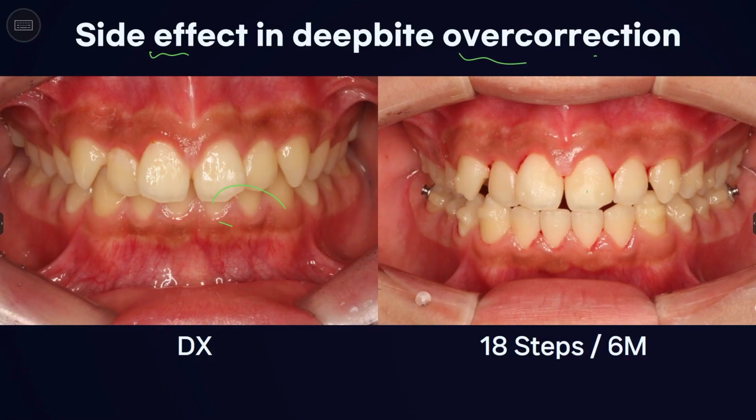So, when deep bite improvement is planned during the staging, it's important to closely monitor the occlusal changes throughout the period. I recommend more frequent observation, such as every 3 aligners or every 4 weeks. That's my final comment for this session.